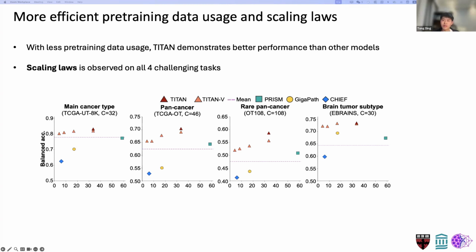Yeah, that's kind of the reason. It is because Conch is, as you mentioned, already aligned with text. Also our Titan text encoder is actually initialized from the Conch text encoder weights. That way makes our slide level alignment easier. But probably in our next iteration of training, we will try to use our UNI v2 model, and hopefully it can give even better performance.